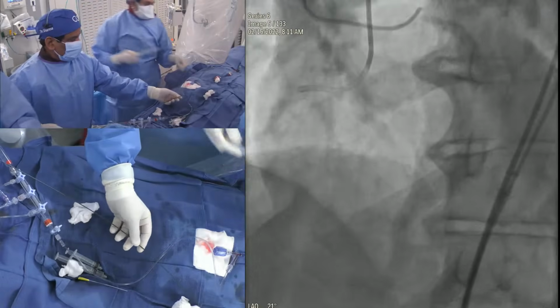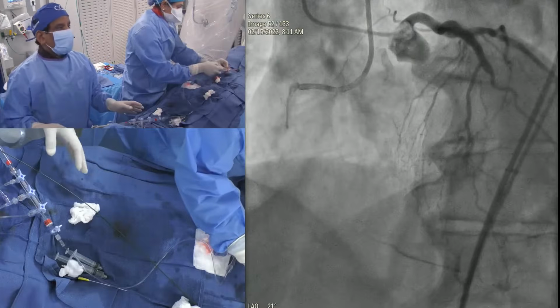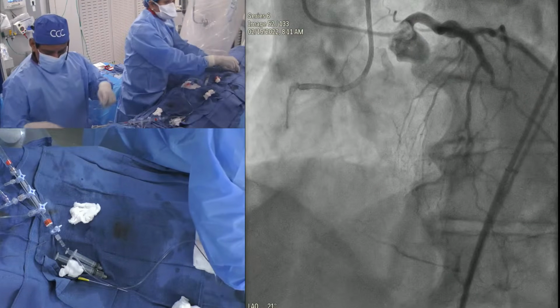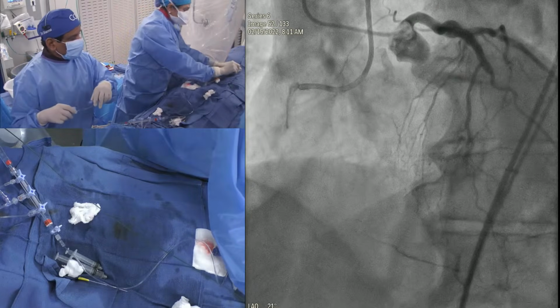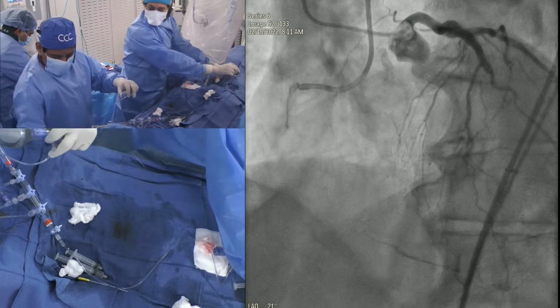You see that septal is not a healthy septal either. And you're planning to go into the distal, the third or the fourth septal, no? Yeah, the other septals have all been stented. We can't go through it, but there's no connection. Connection was third or fourth septal after the stent anyway. You have it? Yeah. I'm going up.